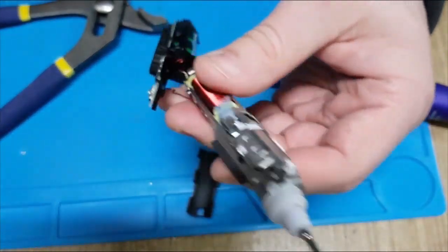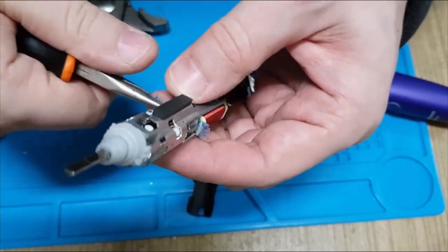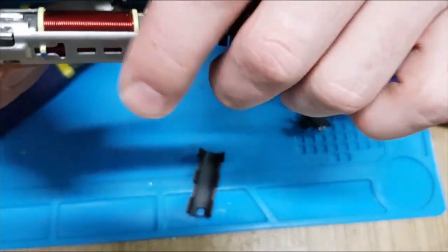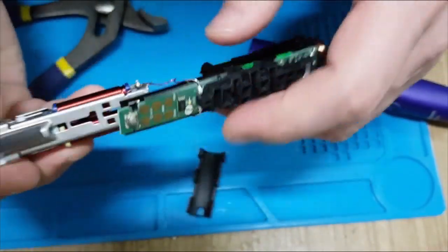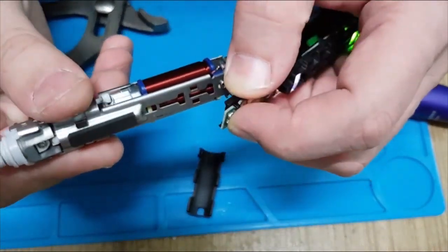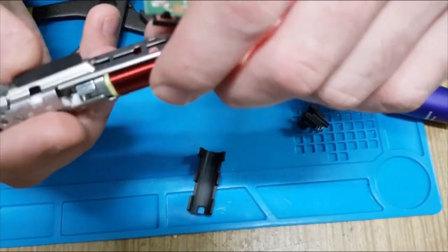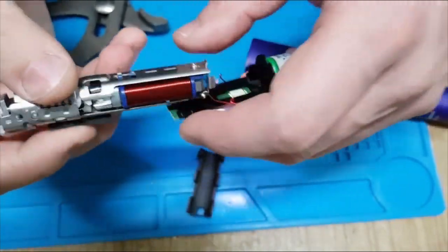Perfect. And then let's take tweezers and pull the plastic out. Perfect. Now what we have, or what we should have, is a little space. Let's see if it works. As you see, vibrations are strong, and yes, there is this 0.5 millimeter space between the magnet and the electromagnet.